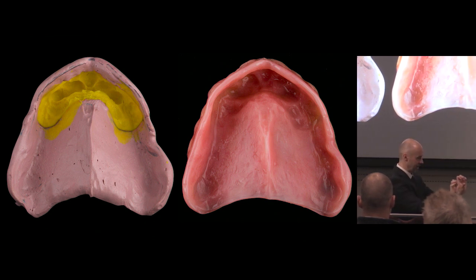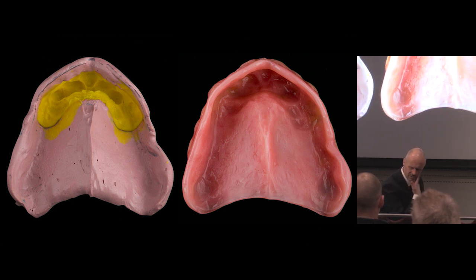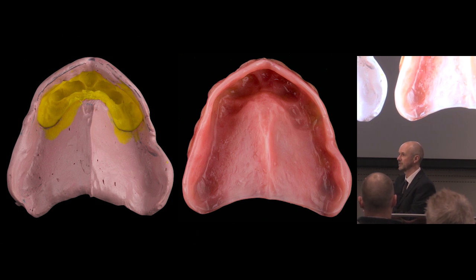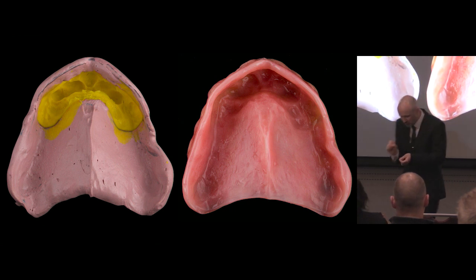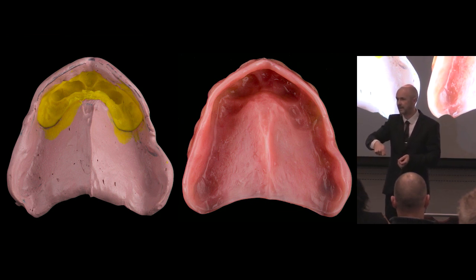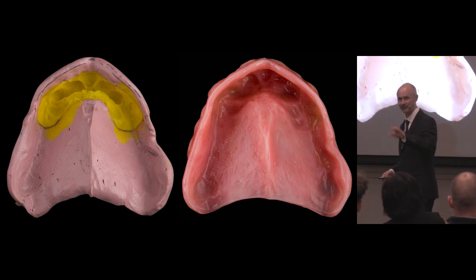So I've got the new denture there. I'm going to fit it and press it firmly up. And if Bert goes, ooh, that's sore there, what I'll do is I'll put a light-bodied silicone impression material on the fitting surface, put it into the mouth, and if it poked through here, I'd just draw on there with a pencil, peel it off, and drill it back. So, good point. I'm not actually covering that today in the lecture, but I've covered it now, so it's good.